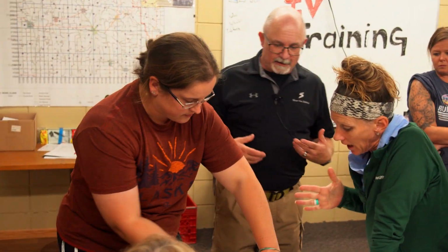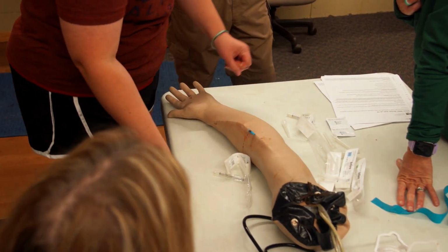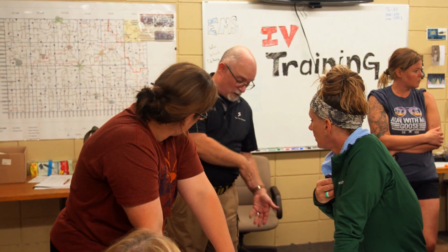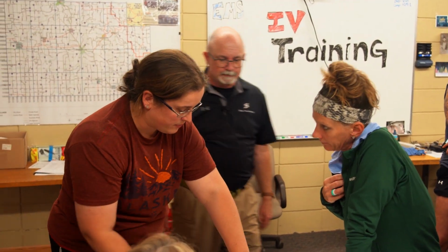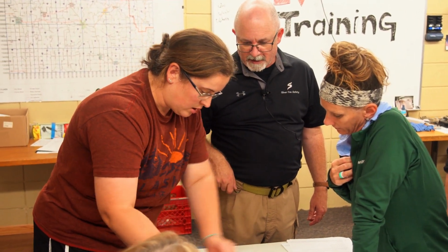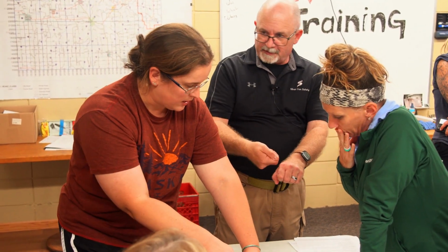Honestly, Chuck's idea isn't bad, to lay, or if you've got them on the cot anyway, by having a blanket on over where you're doing it, kind of helps with that a little bit. So I'm holding pressure here. The reason I'm doing it is because you want to keep the blood from flowing in, otherwise you're going to make it a bigger mess at this point. Then you want to hook up, get that in there.